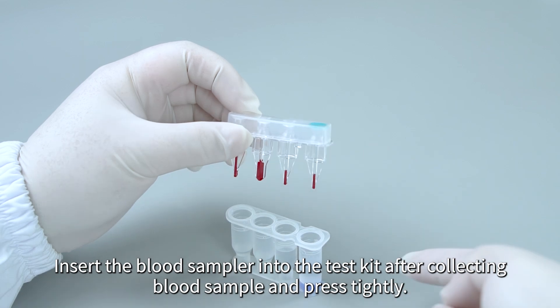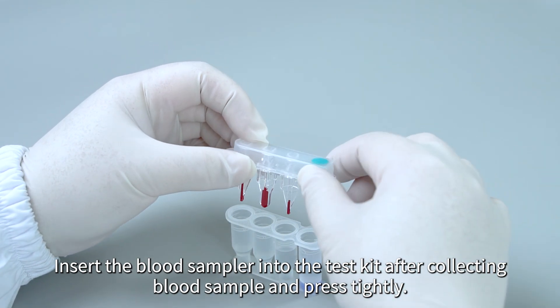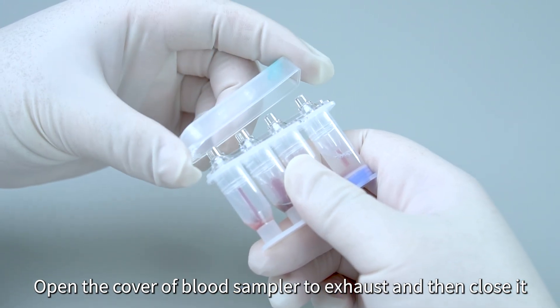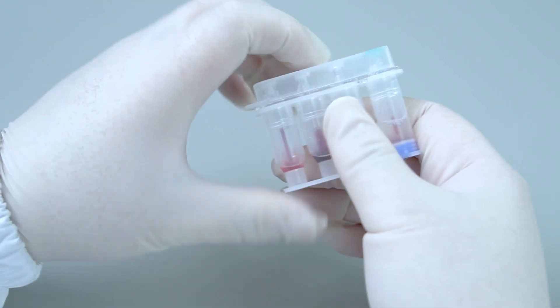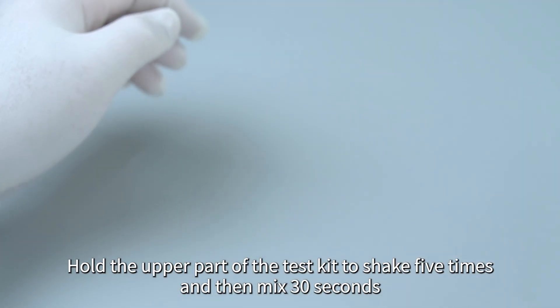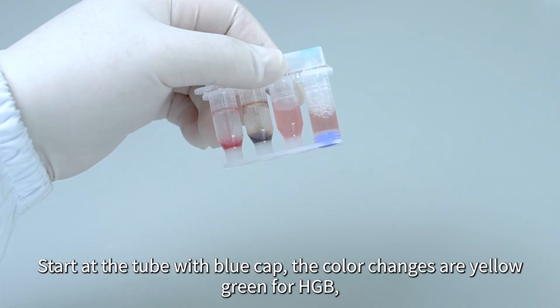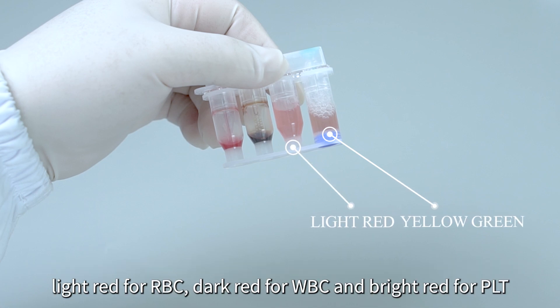Insert the blood sampler into the test kit after collecting the blood sample and press tightly. Open the cover of the blood sampler to exhaust and then close it. Hold the upper part of the test kit to shake 5 times and then mix for 30 seconds. The color changes are yellow-green for HGB, light red for RBC, dark red for WBC, and bright red for PLT.